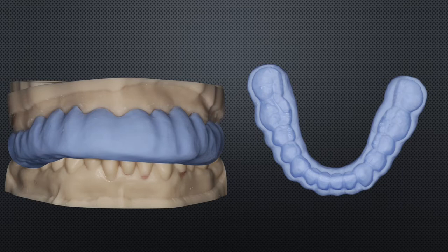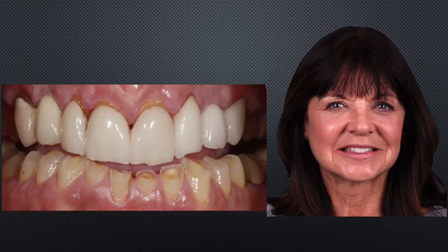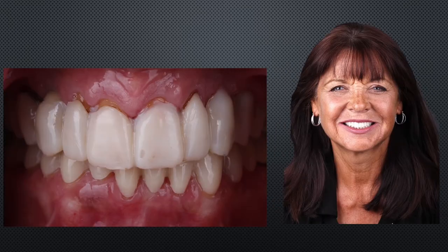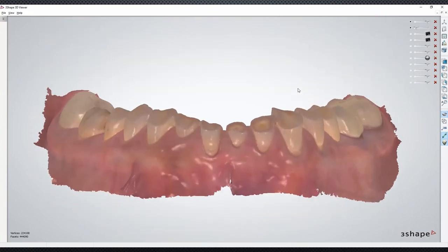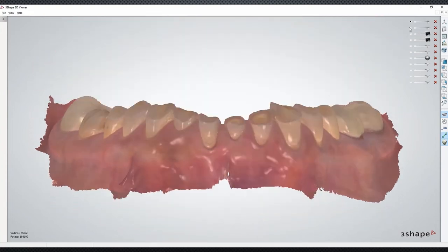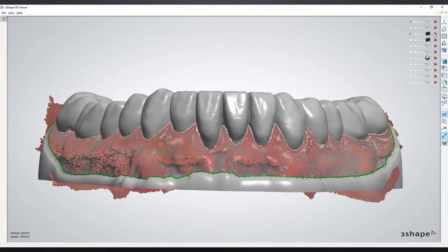The doctor puts it in the mouth, and you can very immediately see the difference, even in confidence, everything like that, right? And she right away is like, okay, I want this, let's do that. So we go ahead, and I open her up arbitrarily, and I make a diagnostic snap-on smile just to hold her open. We're going to do some perio guides, a whole bunch of other stuff in here.